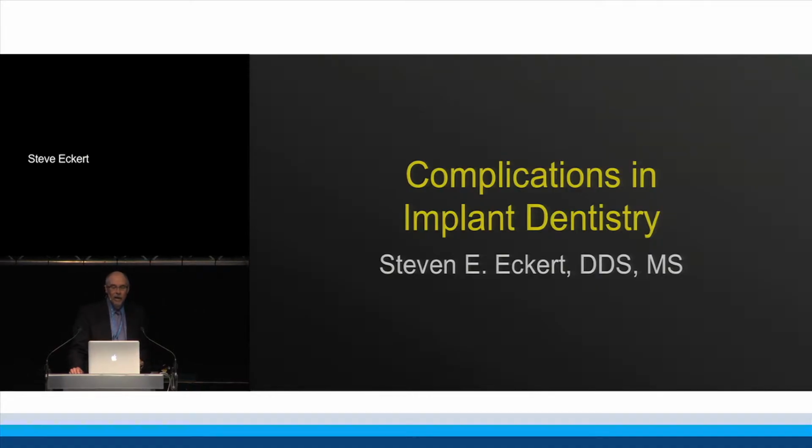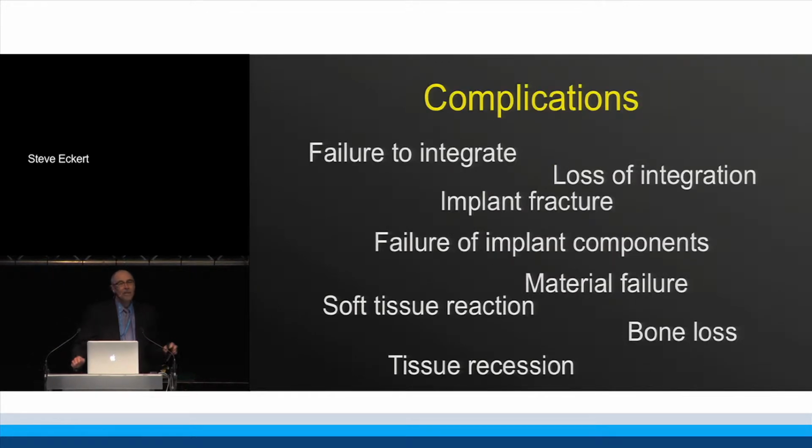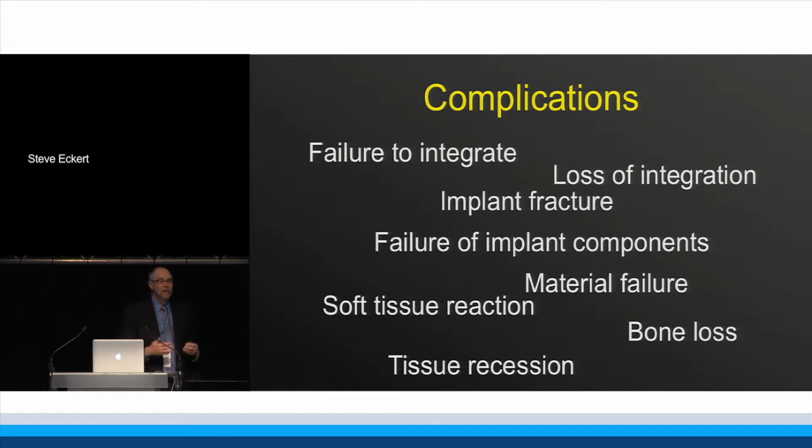All right, so we're going to talk about complications in implant dentistry and specifically complications in prosthodontics. Complications can occur in many different ways. The biggest complication that we started out thinking about in implant dentistry, and the one that's most well documented, is a failure of an implant to integrate.